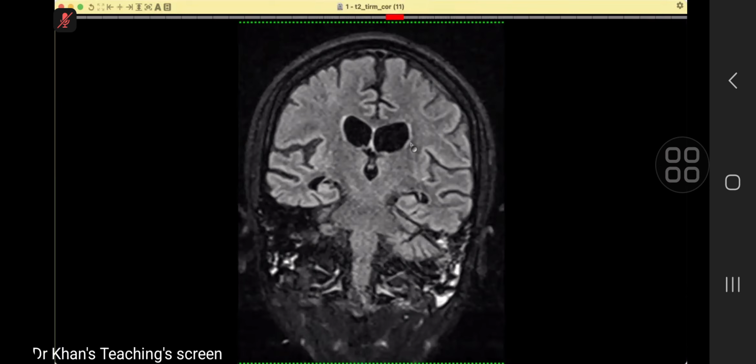Candidate 4. Yes, sir. Now, what happened was that this patient is a 23-year-old male. He was transferred from a peripheral hospital. The patient is delirious.